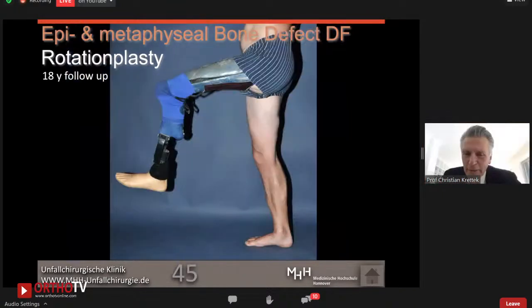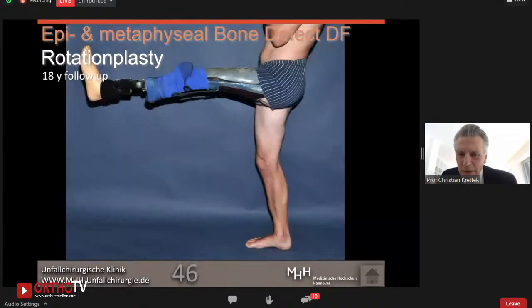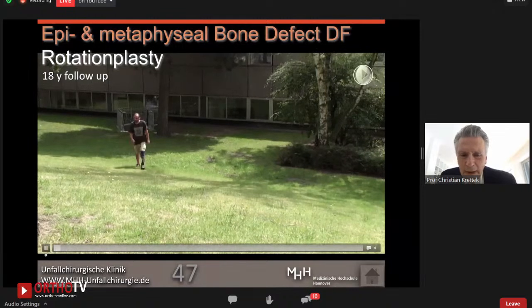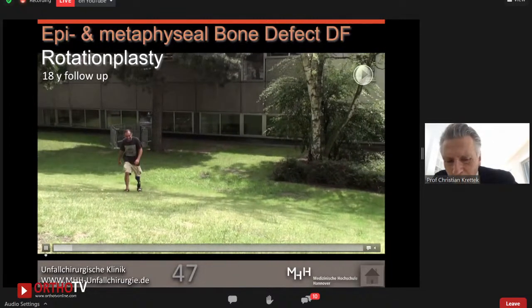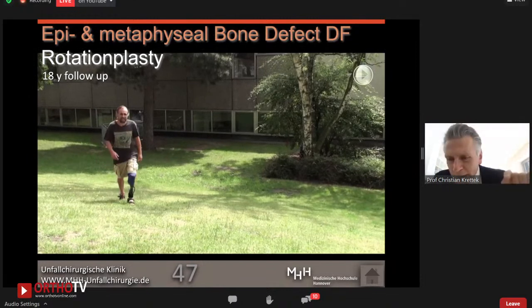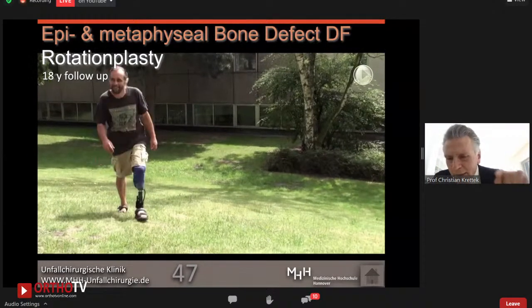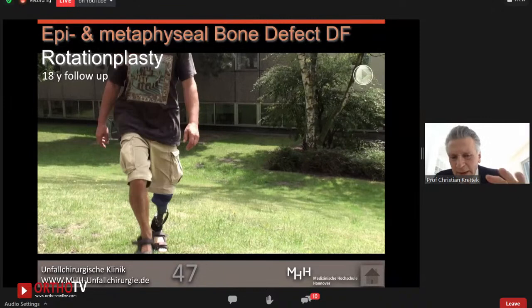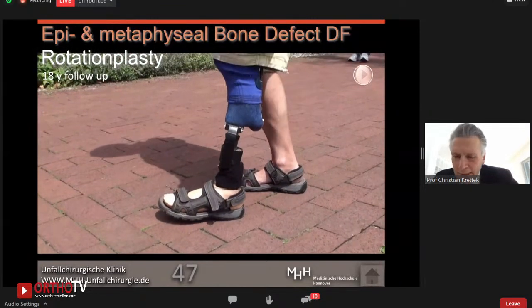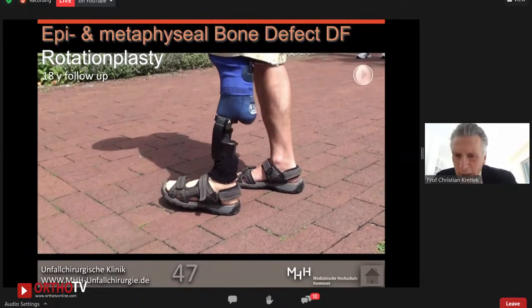And he is a brave man. He is back to work part-time. He is sort of a craftsperson. And look at him. That's the video. That's the video when he is walking uphill. For every femoral amputee, uphill walking is a pain. But he is very confident, very safe, and a very active patient.